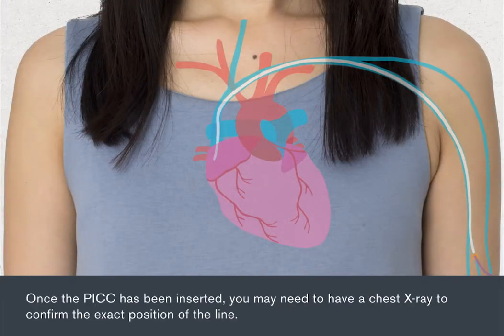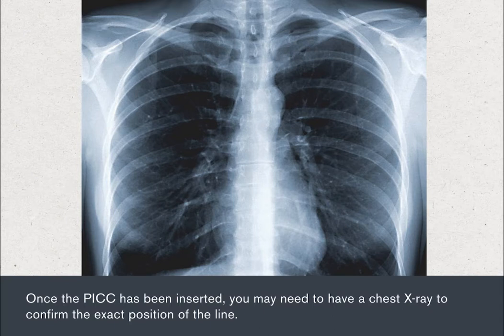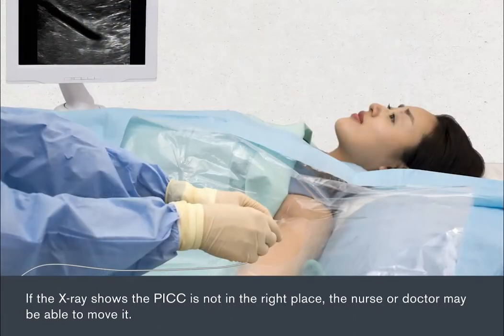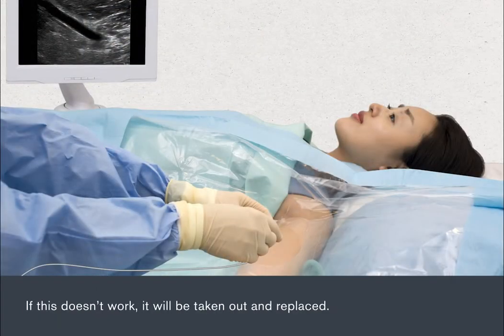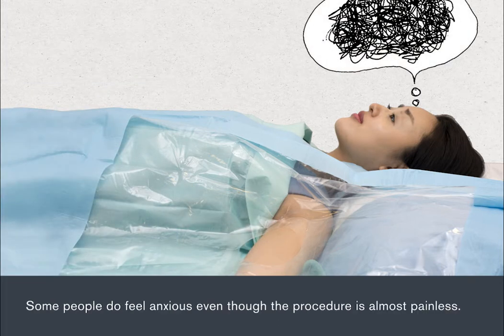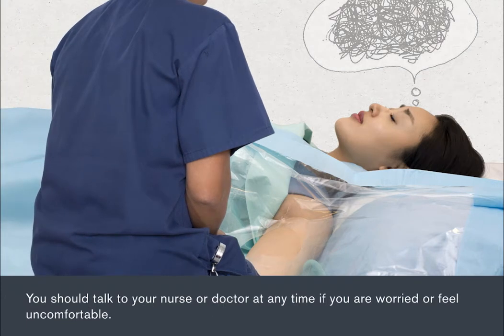Once the PICC has been inserted, you may need to have a chest X-ray to confirm the exact position of the line. If the X-ray shows the PICC is not in the right place, the nurse or doctor may be able to move it. If this doesn't work, it will be taken out and replaced. Some people do feel anxious, even though the procedure is almost painless. You should talk to your nurse or doctor at any time if you're worried or feel uncomfortable.